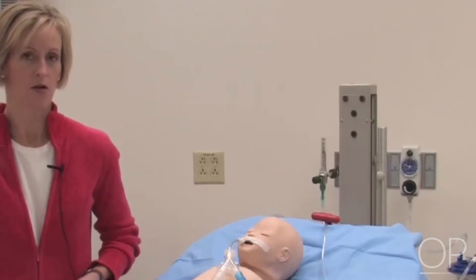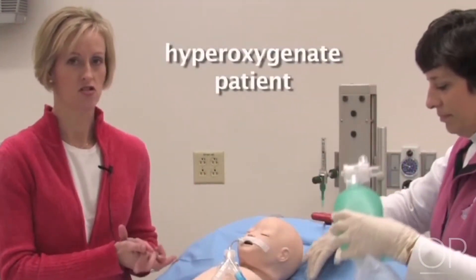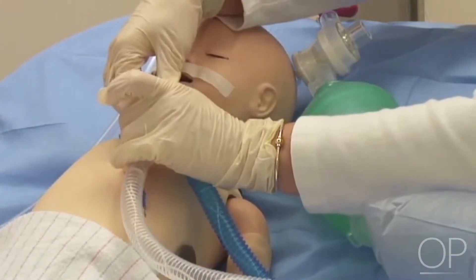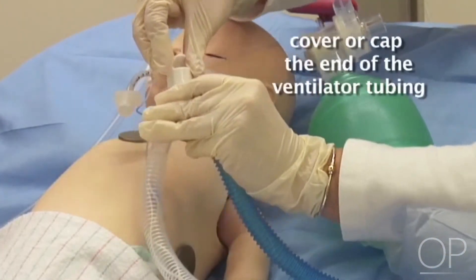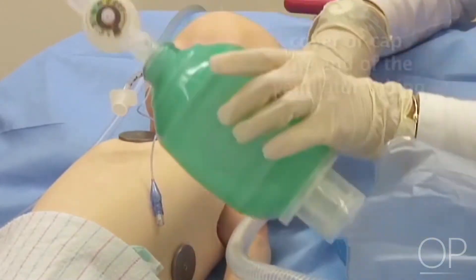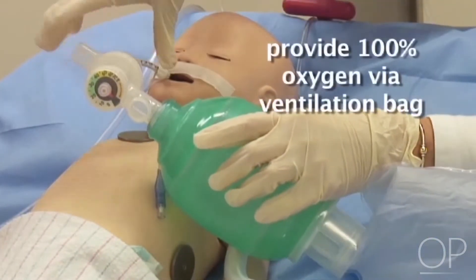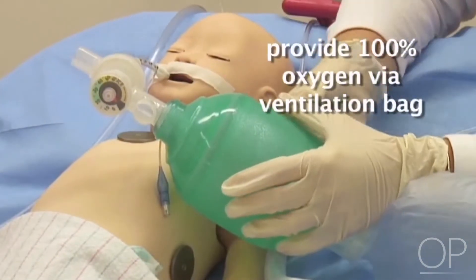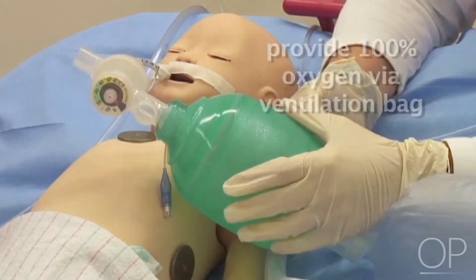As I get ready, I'm going to have my colleague come and start to hyperoxygenate the patient. She'll disconnect from the ventilator and cover or cap the ventilation system in order to maintain its cleanliness, and then she'll provide 100% oxygen to the patient by giving breaths through the bag mask system.